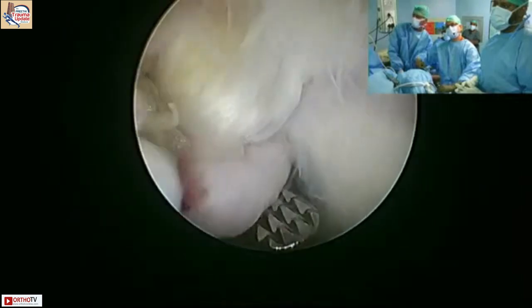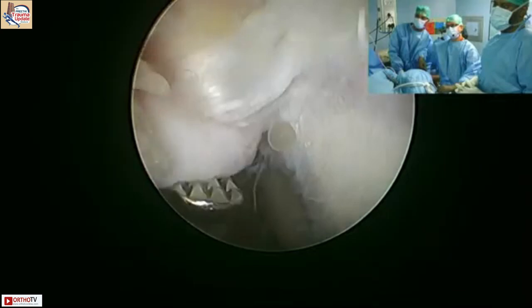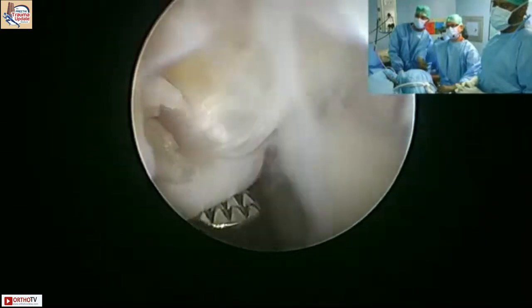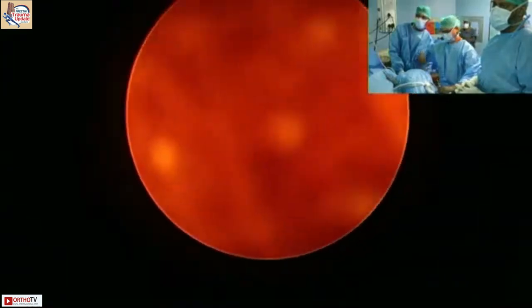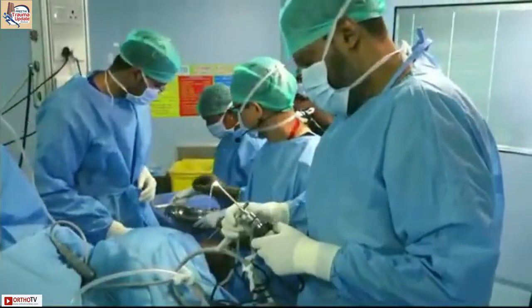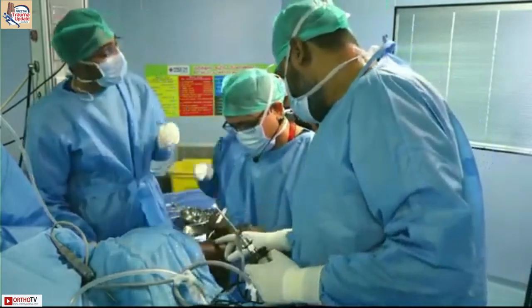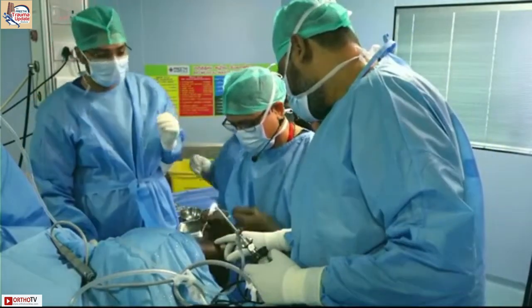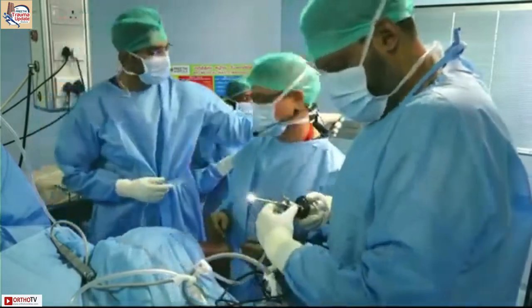What's your take on this new nanoscope technology by Arthrex, a smaller scope, any use of it in the elbow? I mean, if you have a lot of money, yes. If you're in the US and you have a lot of money, then yes, the scopes come out. But most of these can be done with what we use, the 2.3 scope. It's supposed to be disposable. Which we would never dispose of, as Indians.